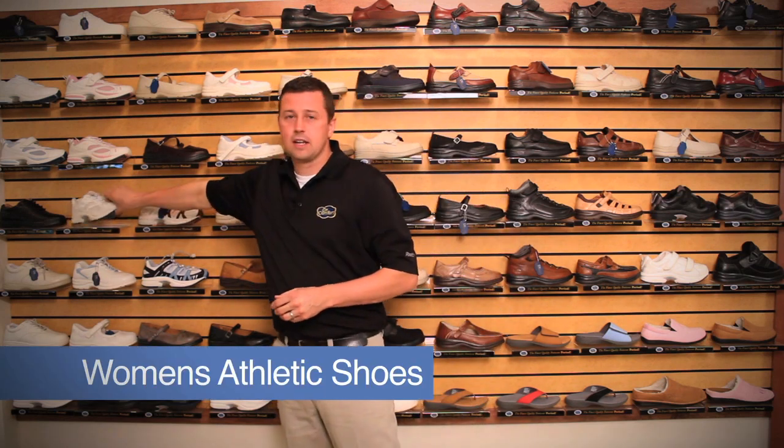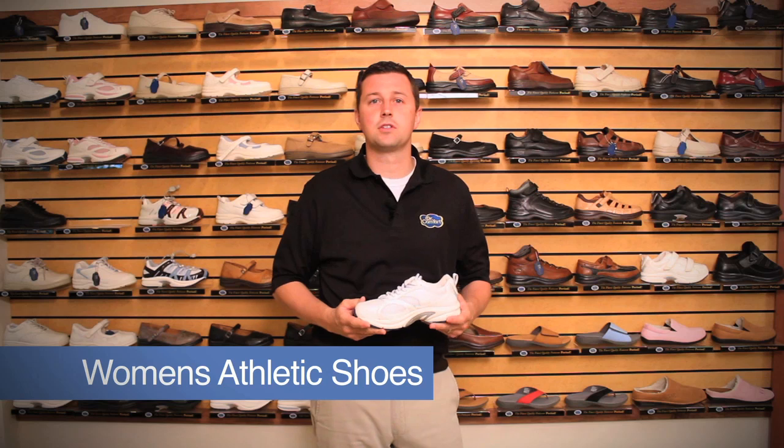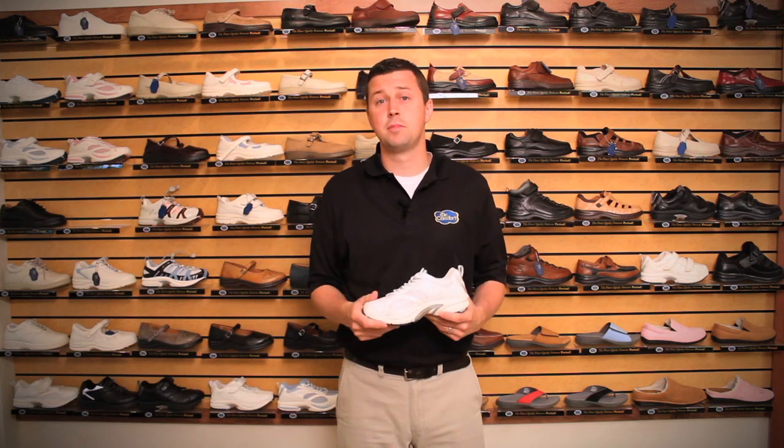At Dr. Comfort, we understand you and your patients' needs. So we have created several different styles of shoes to address those concerns of your patients. Today I'd like to review the ladies' style shoes and some of the special features that make them able to accommodate your patients and their needs. Starting with the athletic line of shoes, our athletic line of shoes are great to address those concerns of just overall stability and support.